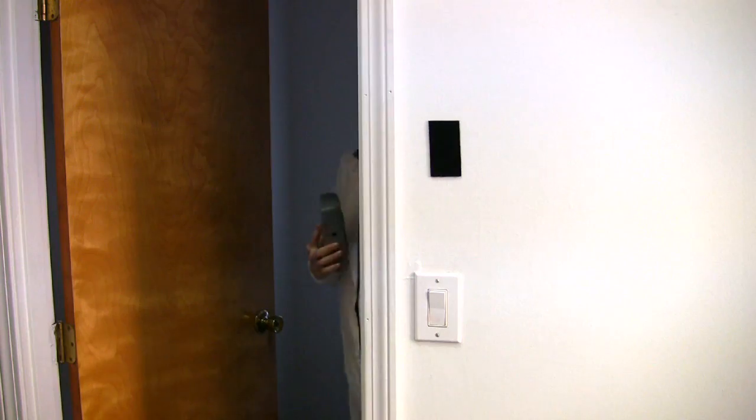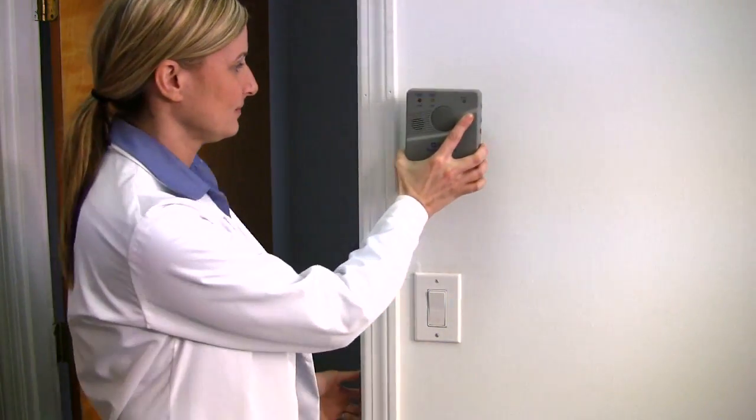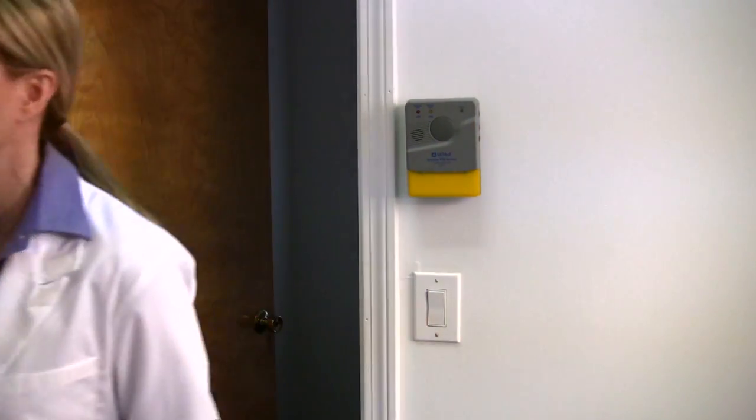Once you've established communication with the PIR unit, mount the receiver unit to the desired location up to 100 feet away. You can mount the unit using the included bracket and screws or by using double-sided tape.